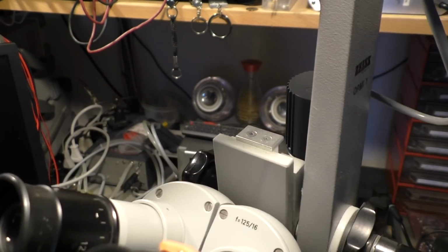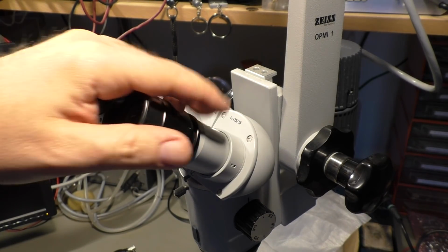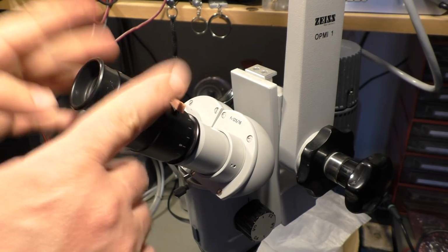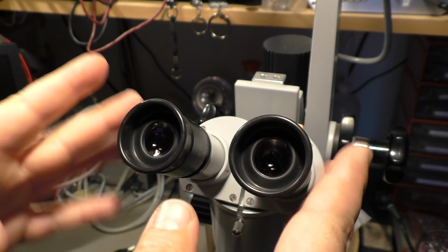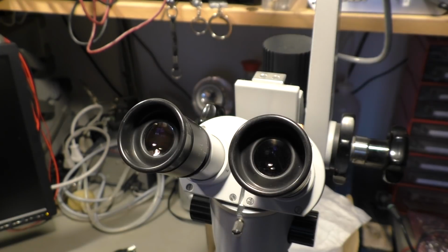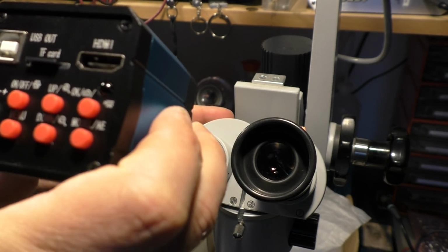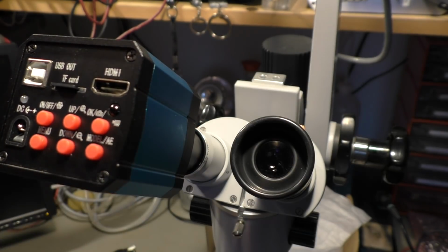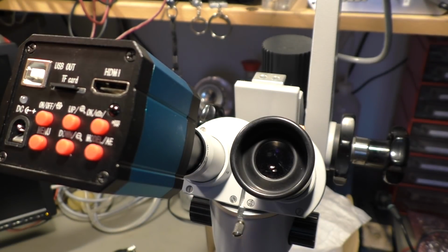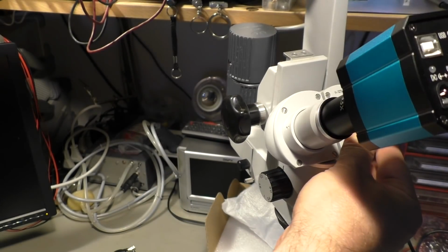You get it with a nice stand. You probably need it, maybe not, but the microscope itself, it's stereo, binocular. You can see 3D, of course, but not with my camera here, because I only have one camera, so we only see 2D. And the modified adapter seems to fit. So that's how it looks now.